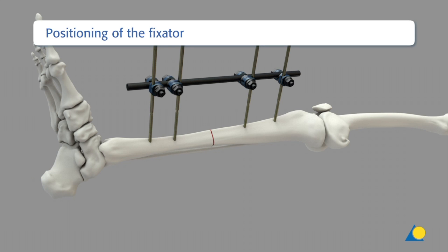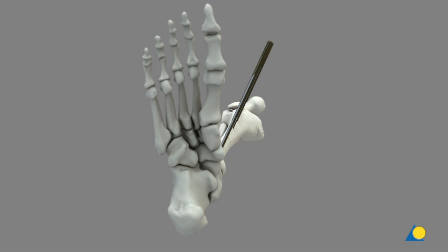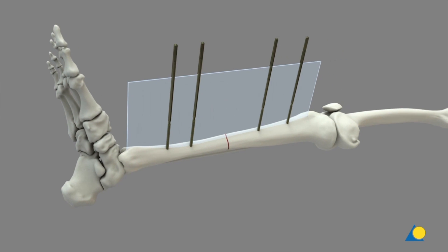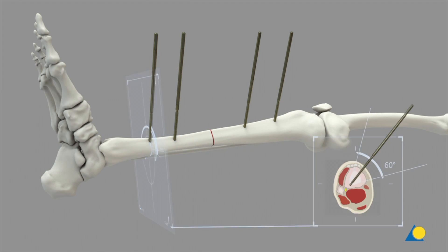An anteromedial position is recommended for the placement of the uniplanar external fixator. The Schanz screws must be placed in the same plane and in the safe zones. In general, the Schanz screws should be placed medial to the tibial crest. This placement is particularly important in the distal tibia to avoid interference with the tendons and neurovascular bundle.